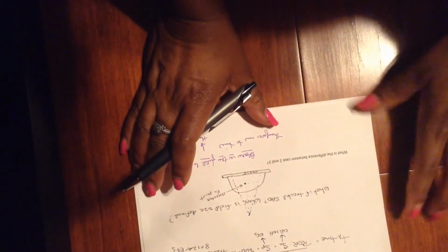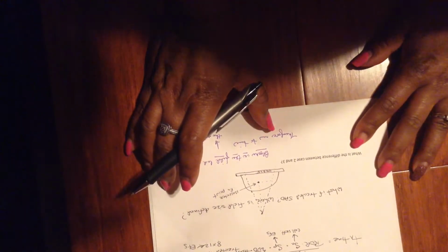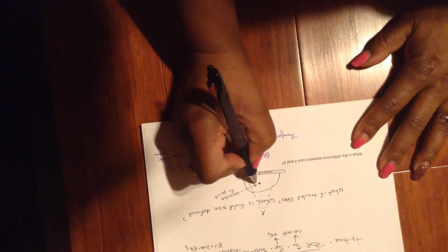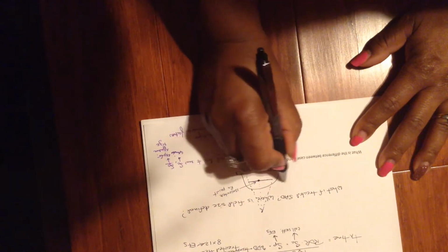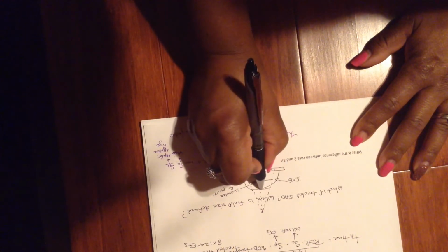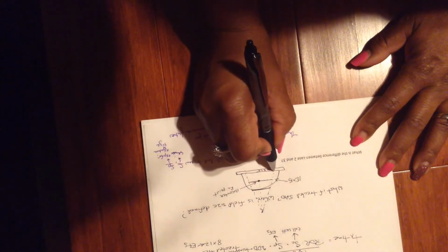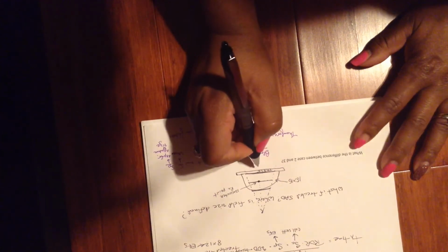So in an SAD technique, the isocenter would be inside the patient. If the field size setting is 15 by 15, then the field size is 15 by 15 here, because that's where isocenter is. On the patient's skin, the field size would measure smaller. On the patient's posterior surface, the field size would measure larger.